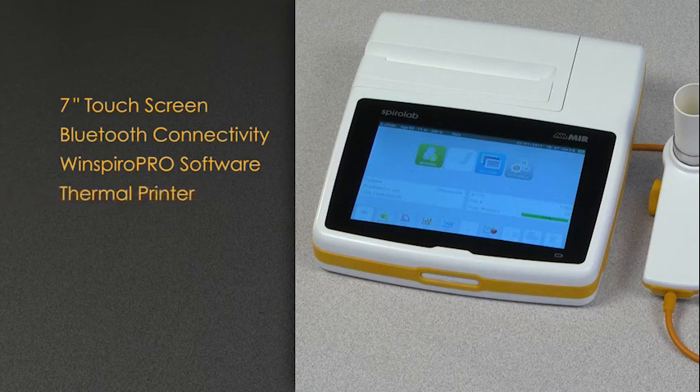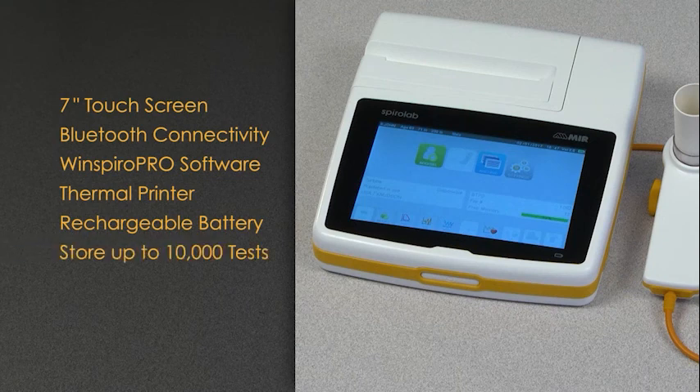The SpiroLab has a fast built-in thermal printer with a customizable printout format, or it can be connected directly to an external printer to provide a full-page spirometry report. The SpiroLab has a long-life rechargeable battery and the memory capacity to store 10,000 spirometry tests.